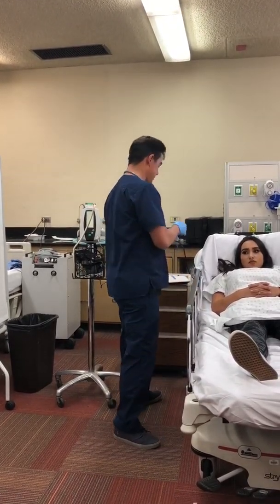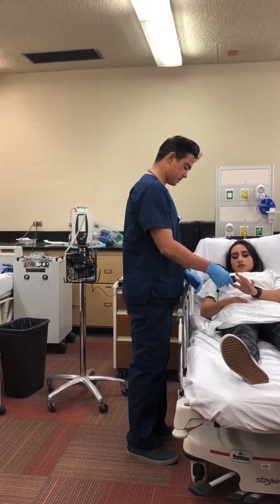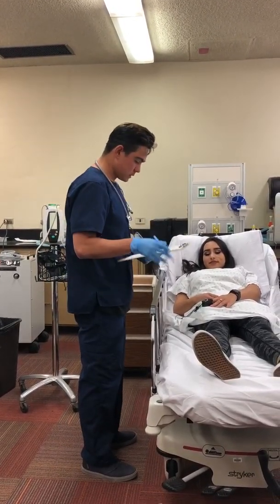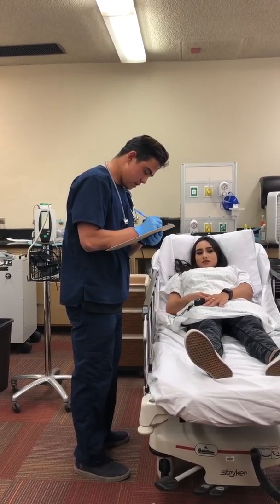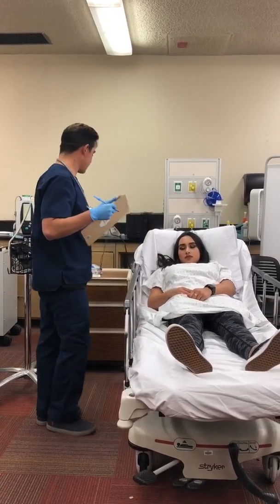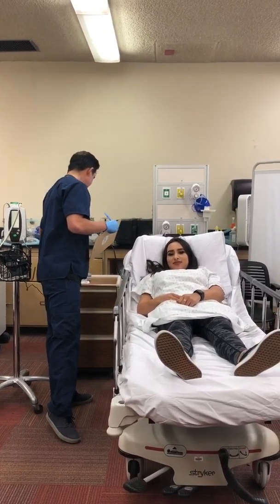I'm going to go ahead and put this pulse oximeter on you. It's going to measure your pulse as well as how much oxygen you have in your blood. So I'm going to leave that on there. Read the recording. Okay. We're at 98% and a heart rate of 68. We can look for the pleth on this, make sure we have full equal bars to determine an accurate reading.